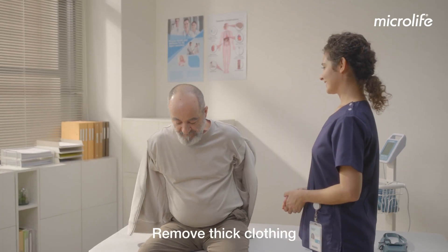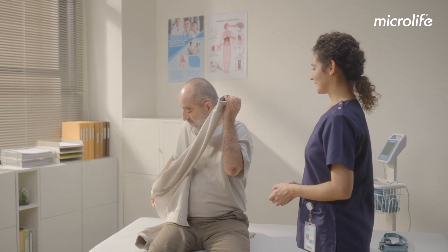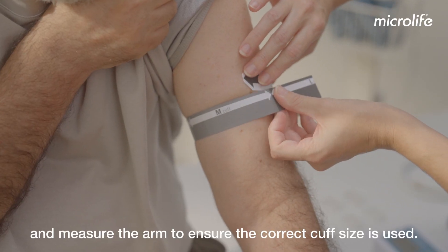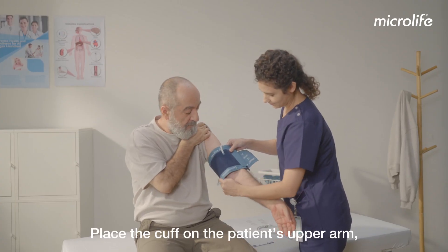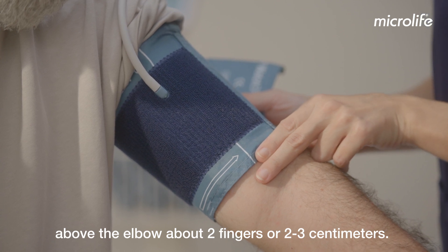Remove thick clothing and measure the arm to ensure the correct cuff size is used. Place the cuff on the patient's upper arm, above the elbow, about two fingers or 2-3 cm.